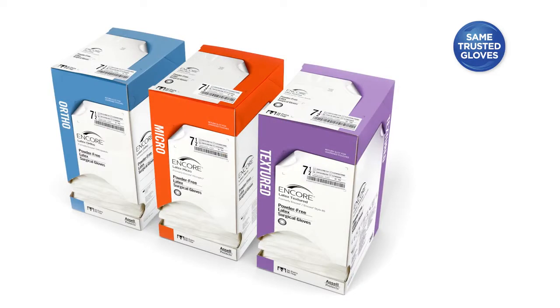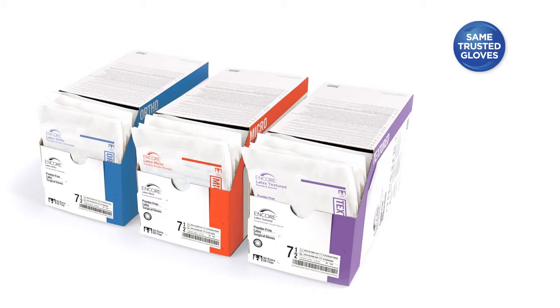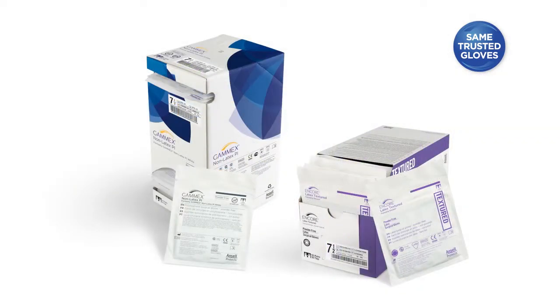Best of all, these unique boxes may be stacked and opened either vertically or horizontally, whichever way is most convenient for you. With our new user-friendly packaging designed to fit how you work, you will enjoy your favorite Ancel gloves with all the conveniences our new pouch and dispenser packages offer.